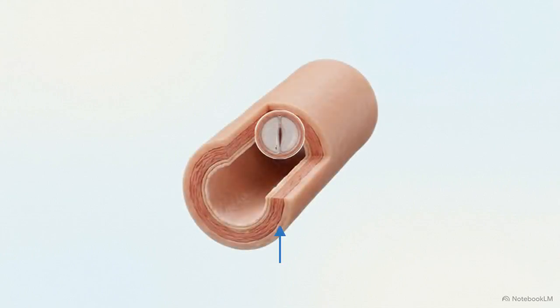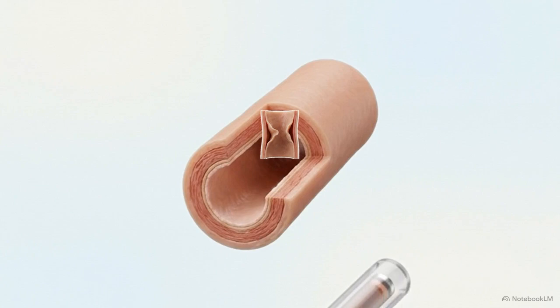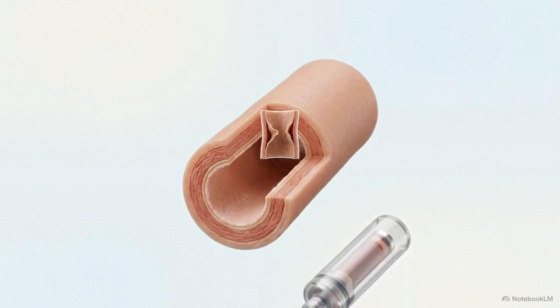To understand chronic venous disease, we start by looking at normal blood flow. When the bileaflet valves in the great saphenous vein function correctly, blood moves steadily upward. But when these valves fail to close, blood pools and flows backward, creating the superficial truncal reflux that drives varicose veins. The established baseline for correcting this reflux is endovenous thermal ablation.